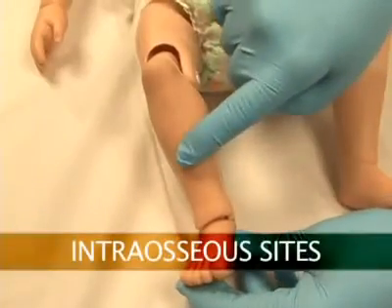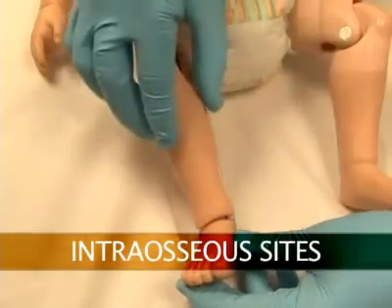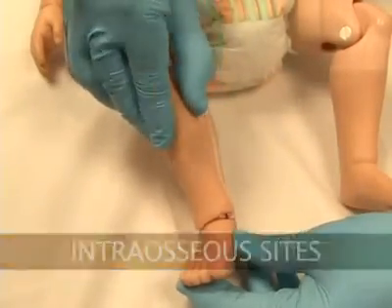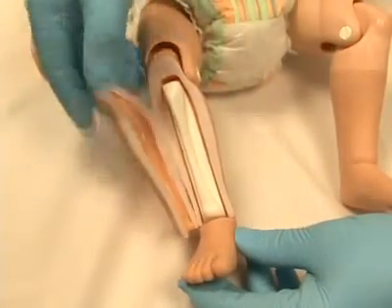The lower right leg has an intraosseous injection site with replaceable tibia bones.